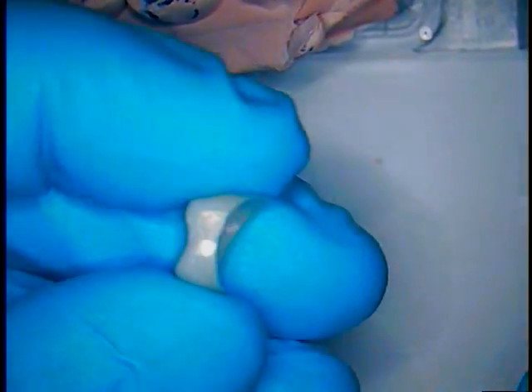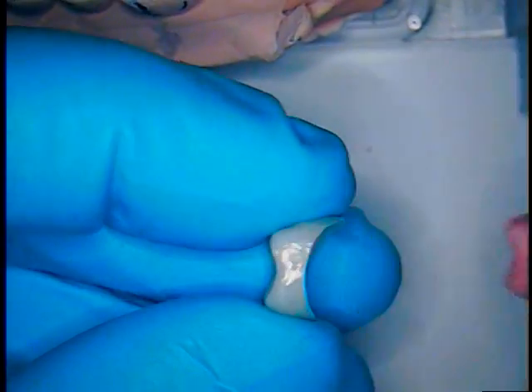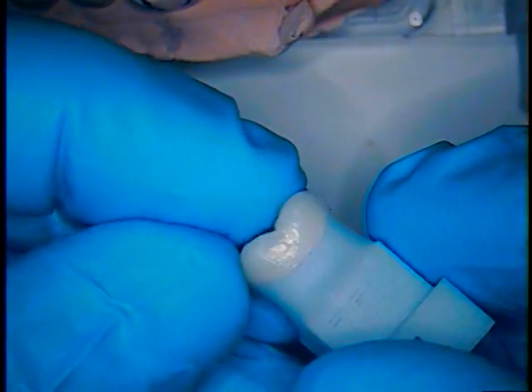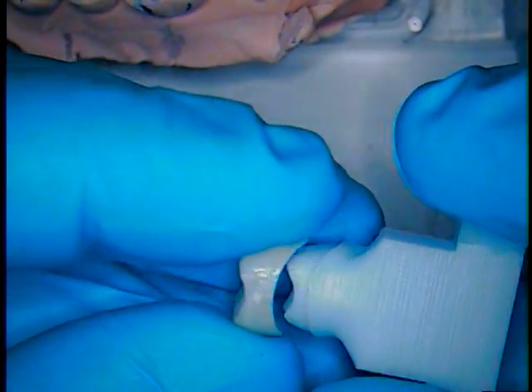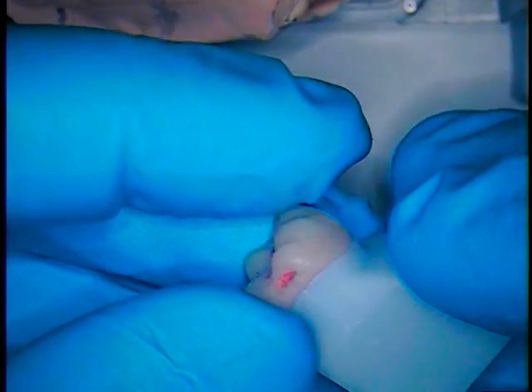Let's just see how tight it is. Absolutely no resistance whatsoever. So there is some die spacer that's applied to the program, and I'm not really going to cover that right now. Again, we're just observing our results. So a little tight on the final die here.